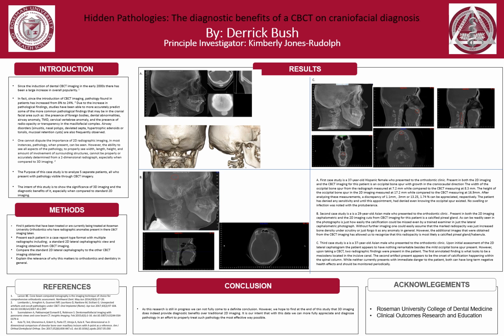However, when you take the CBCT cuts, you can really see and appreciate the actual calcification taking place in that little dot that just appears there, and it really pops out a lot further. While it's not a huge anomaly, it is important to present to the patient that, hey, you are getting this calcification going on. This may affect the amount of melatonin being produced because of the calcification of this gland. You may have sleep issues, which is important for us if they were to report this in the near future, or any time in the future. We could help the patient realize why this is happening.